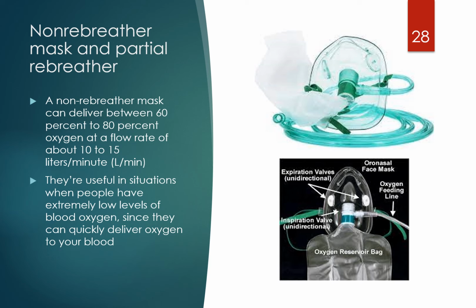This is a great mask for patients who are really, like someone with CO2 retention. No, I'm sorry, take that back. Someone with carbon monoxide poisoning can benefit from this type of mask. You put them on 100% FiO2 and a high liter flow at 10 to 15 liters. They have the reservoir bag. I wanted to point out what's the difference between a non-rebreather and a partial rebreather.